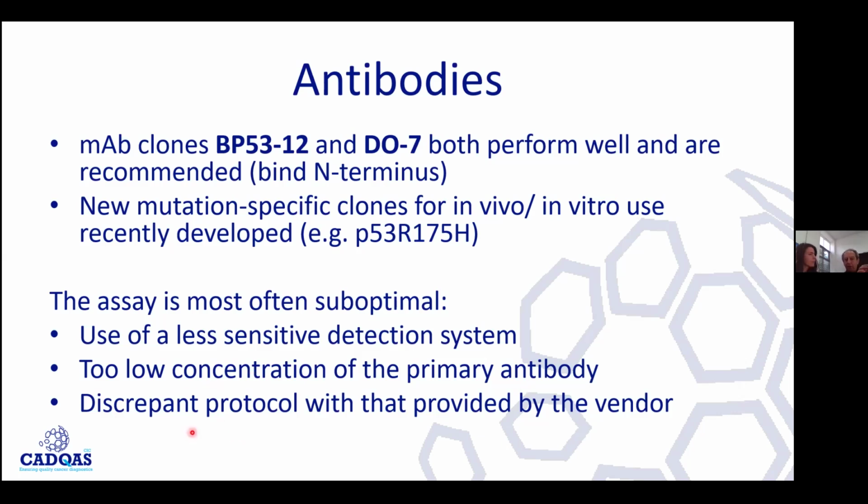Again, at the beginning, all these things were not really very well described. And so there was this notion that immunohistochemistry is not the right tool to investigate this protein, because some antibodies stain and some antibodies don't stain the same tissue, where I can demonstrate overexpression, I can extract, I can run gels, it's there, and then this antibody doesn't stain.